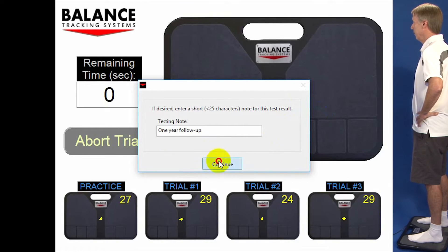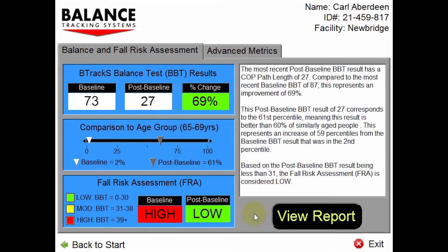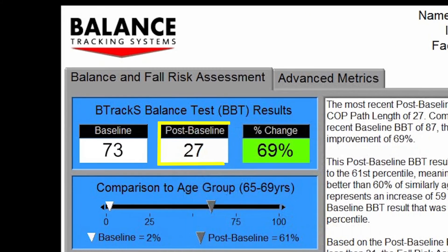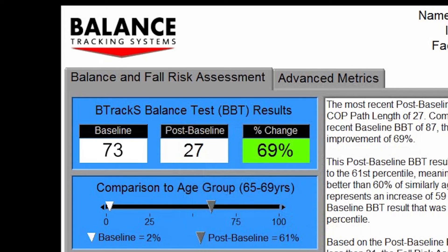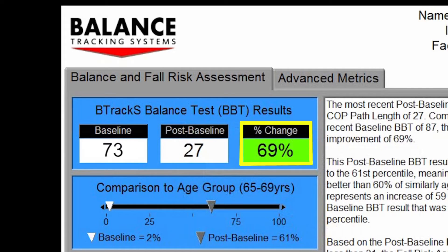Now let's examine the results. The BBT result was 27 centimeters of postural sway, also referred to as the path length — the length of the squiggle if you straightened it out. This is a Post Baseline BBT and is compared to the baseline BBT of 73 centimeters, which is a 69% improvement.